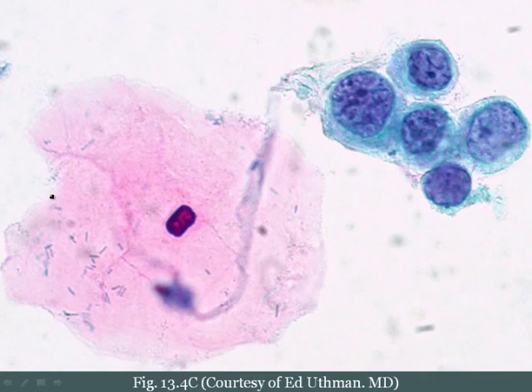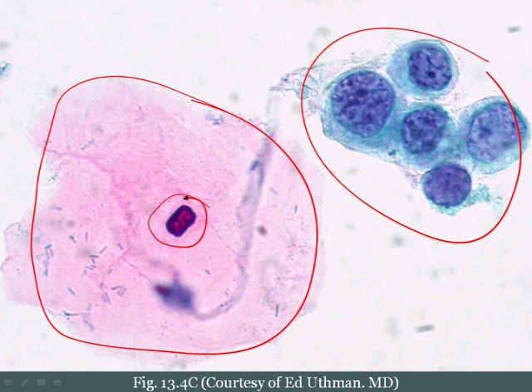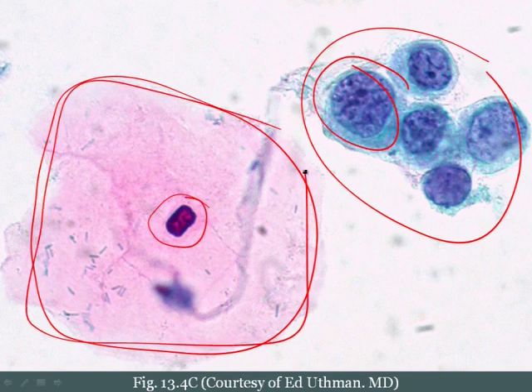All right, so here's a picture of cytology, and this is a picture of a Pap smear. Basically, this is a normal squamous cell, and these are the malignant cells, and you can clearly see, compare the nuclear size. This nucleus is tiny, this nucleus is huge. This cell has a very low NC ratio with a lot of cytoplasm and a little bit of nucleus. This cell has a very high NC ratio, a lot of nucleus, a very little bit of cytoplasm.